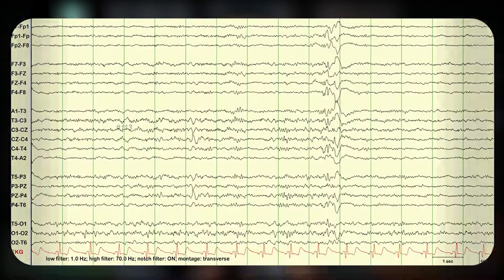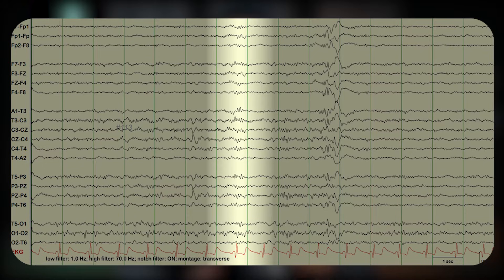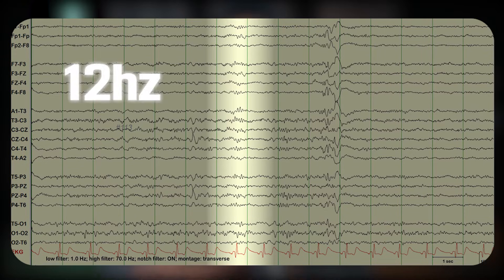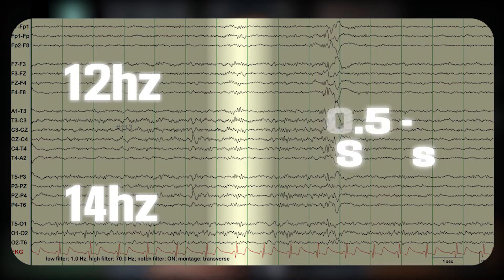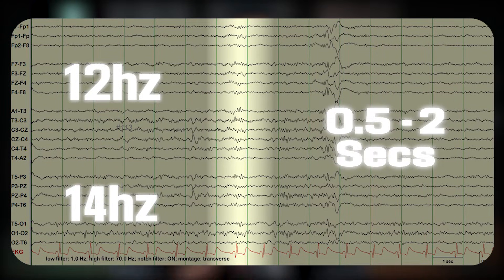Sleep spindles are transient bursts of rhythmic activity in the 12 to 14 Hz range, lasting about 0.5 to 2 seconds. These sinusoidal waves exhibit a waxing and waning pattern and are most prominent in the central regions of the brain, often extending to the frontal areas at slightly lower frequencies.